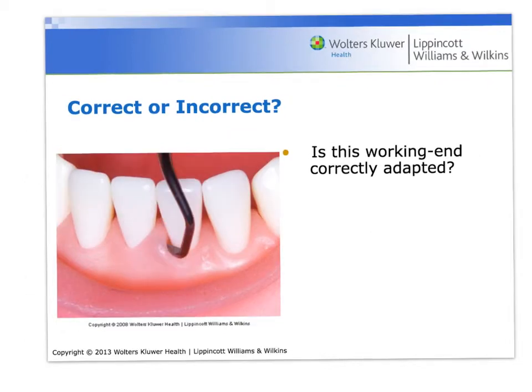And correct or incorrect here? That is incorrect. The incorrect adaptation is a mistake commonly made by beginning clinicians when moving from the facial surface onto the distal surface.